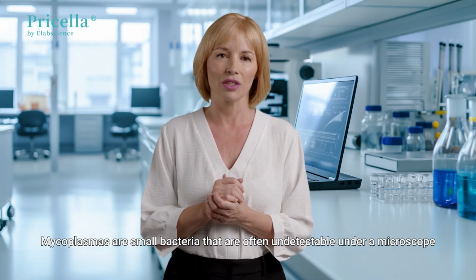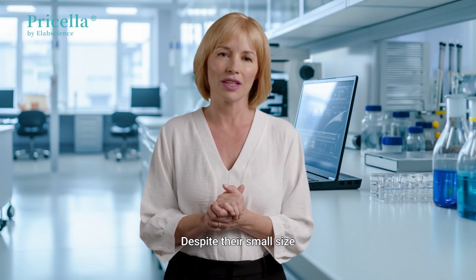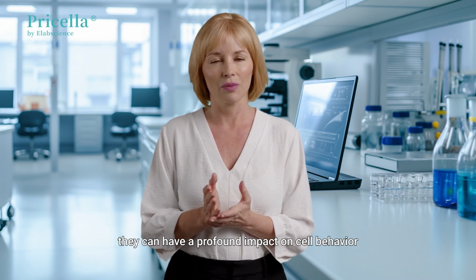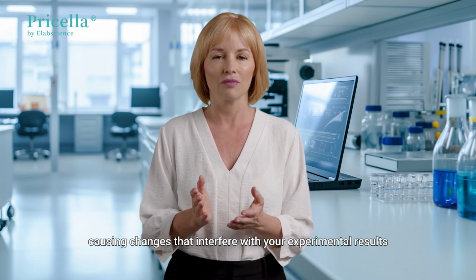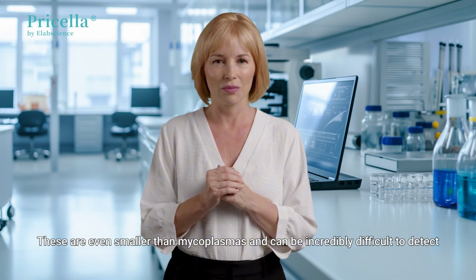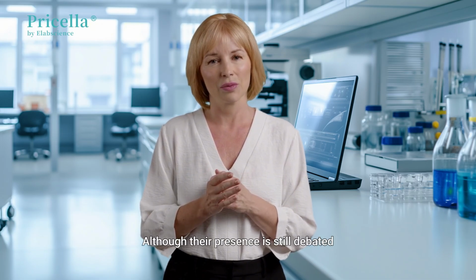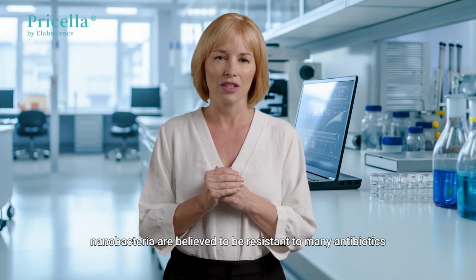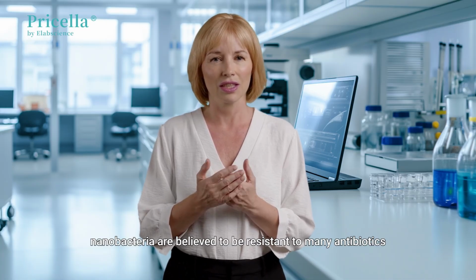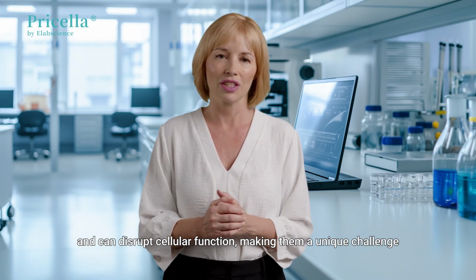Then there's mycoplasma contamination. Mycoplasmas are small bacteria that are often undetectable under a microscope. Despite their small size, they can have a profound impact on cell behavior, causing changes that interfere with your experimental results. And lastly, we have nanobacteria contamination. These are even smaller than mycoplasmas and can be incredibly difficult to detect. Although their presence is still debated, nanobacteria are believed to be resistant to many antibiotics and can disrupt cellular function, making them a unique challenge.